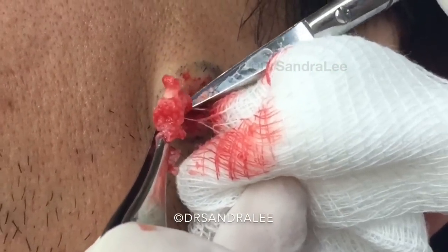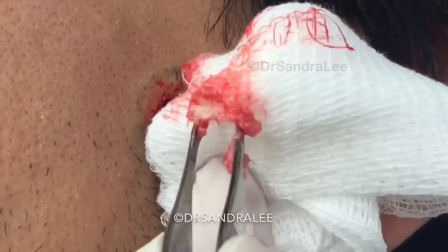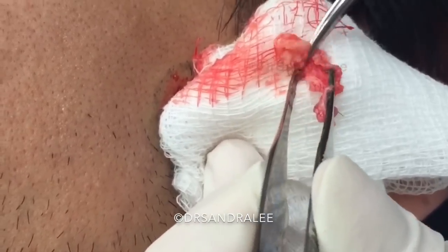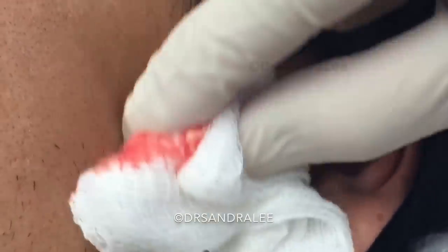So a cyst — I'm sure Aaron told you this too — is in like a little sack, and we have to make sure we get the whole sack out, otherwise part of it can recur. I'm pretty sure that was the bottom of the sack. You can see the sack edges, and this is all the contents inside. It's kind of like a cheesy little discharge. It was kind of deep underneath there.